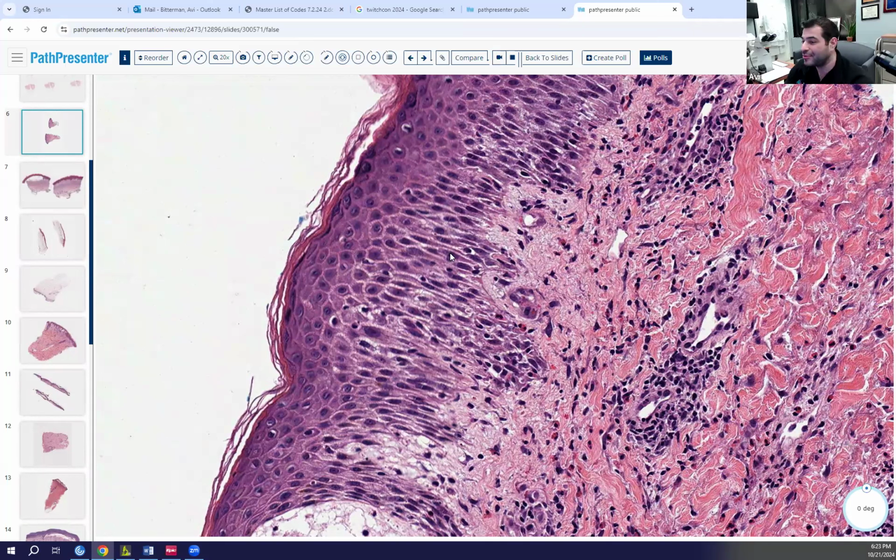And specifically in this case, if this is pemphigoid, what phase of pemphigoid would it be? Very early, before the split. So what's urticarial BP? You've got to think about urticarial BP. Okay. What else? Incontinentia pigmenti, IP. E is for erythema toxicum neonatorum, ETN. And then D is drug eruption. Good.